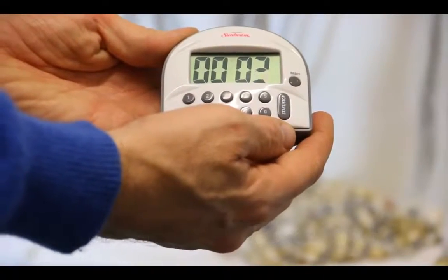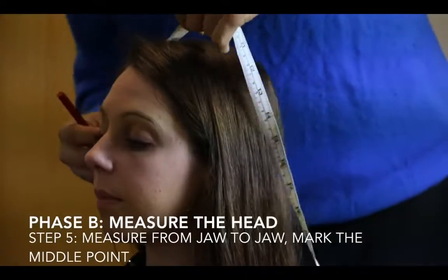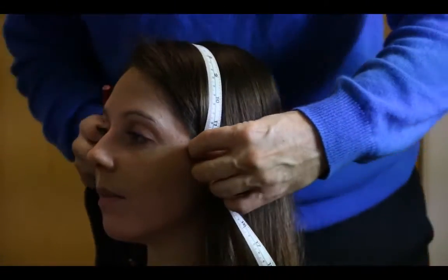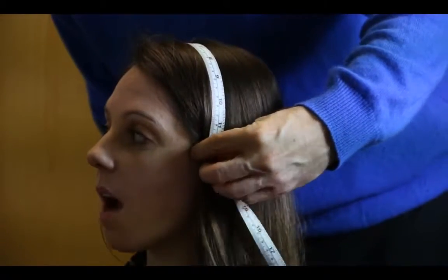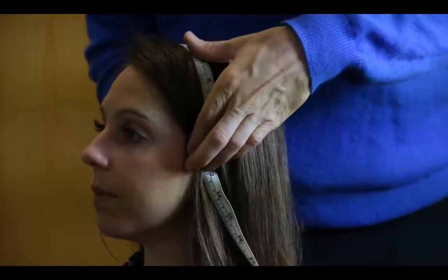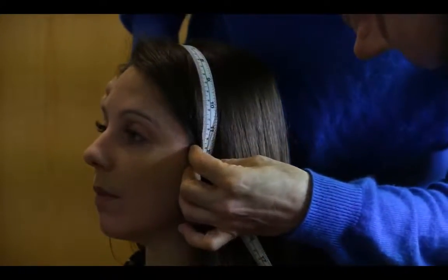Next, you're going to take some other measurements to find the exact center of the participant's head. First, measure from jawline to jawline. You may need to ask the participant to open and close their mouth so you can feel where the top of the jaw is. Once you've found the exact center, make a mark with crayon.